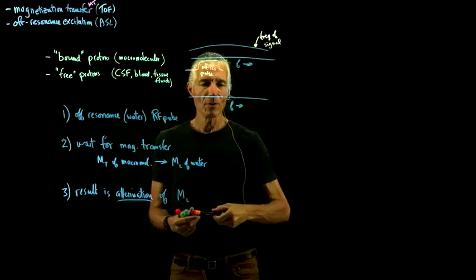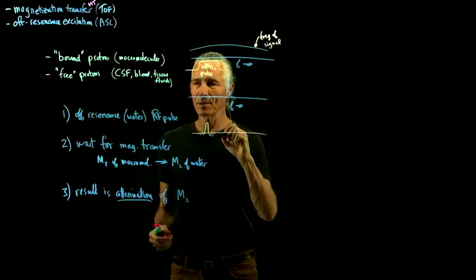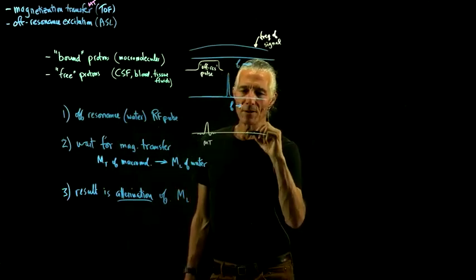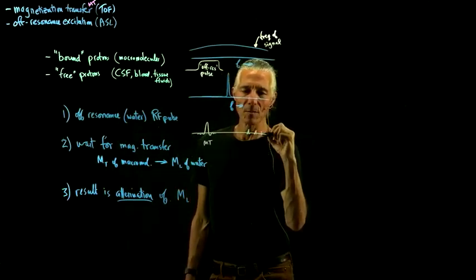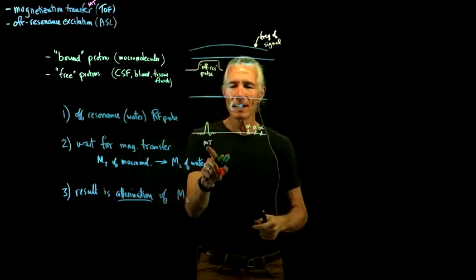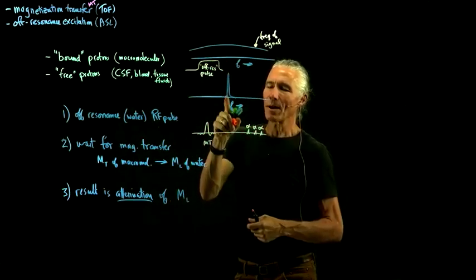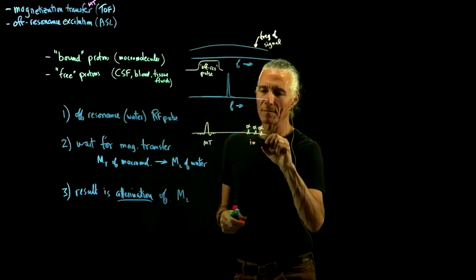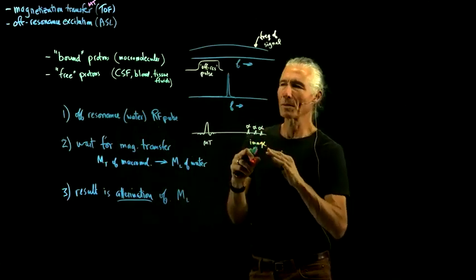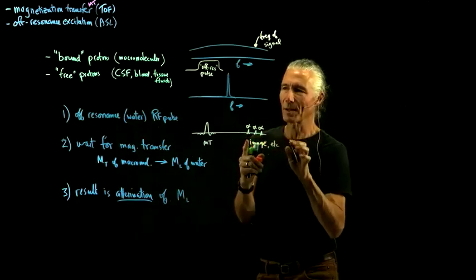So what you would do is you would first do this magnetization transfer pulse, MT pulse, and then do whatever you need to do. Say you were doing a gradient echo where you have a whole bunch of alpha pulses to record your image. So you basically just do a magnetization transfer pulse, wait for it to leak into the water protons, then make an image. So here's where we make our image, and that's our whole pulse sequence for making the image, which we haven't talked about the details yet, but there's a whole bunch of parts to that. There's going to be thousands of things here.